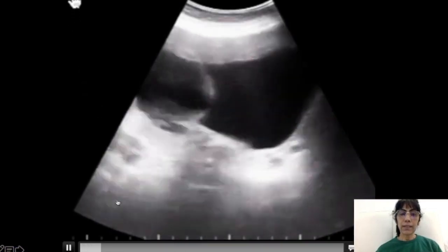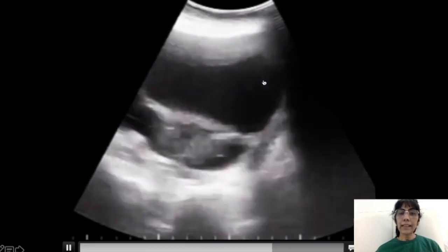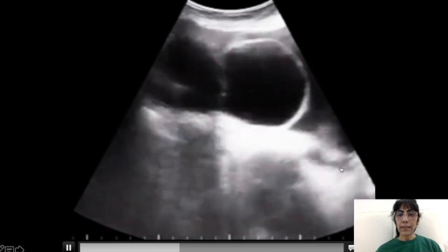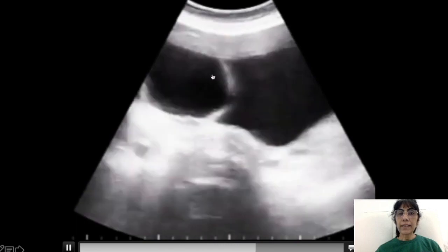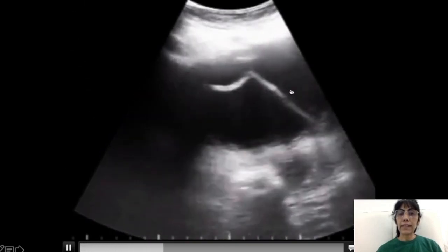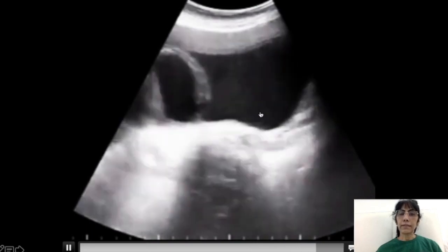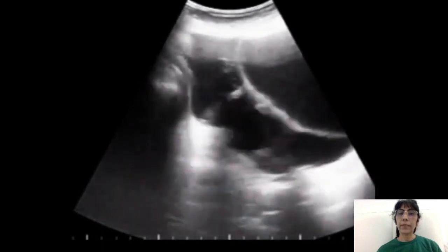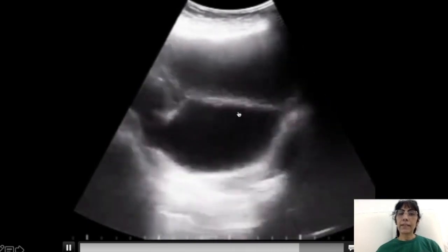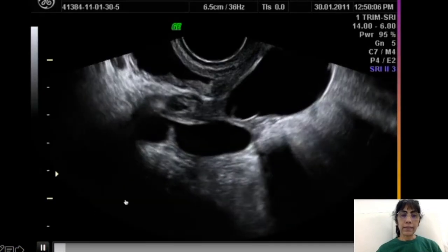Looking at this first example, you can see multiple septations, but notice that you will not find anything in between them — no organ, no bowel loop, nothing. Everything is at the sides, being pushed to the sides. Yes, we do see enhancement and bowel areas on the sides, but inside this mass you don't find anything caught up or entrapped. It's just a multiseptated clear mass. This was basically a cyst adenoma. Further evaluation with Doppler can confirm there is no malignancy; since mostly cystic areas are seen with no solid areas, it is likely a benign tumor.